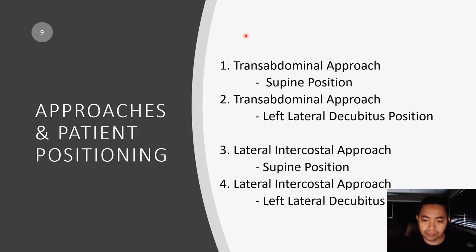This slide summarizes the commonly used patient positioning and scanning approaches for HBT ultrasound. We have the transabdominal approach supine, transabdominal left lateral, the lateral intercostal supine, and the lateral intercostal left lateral decubitus position.